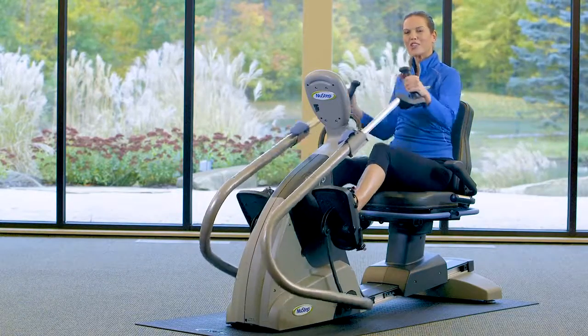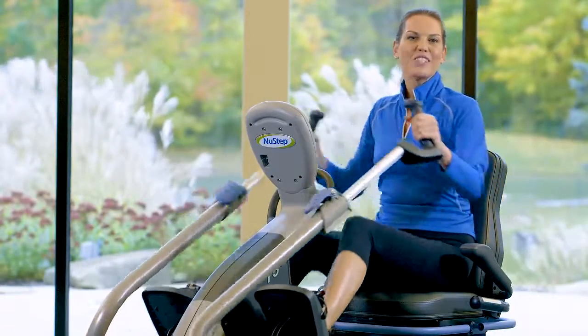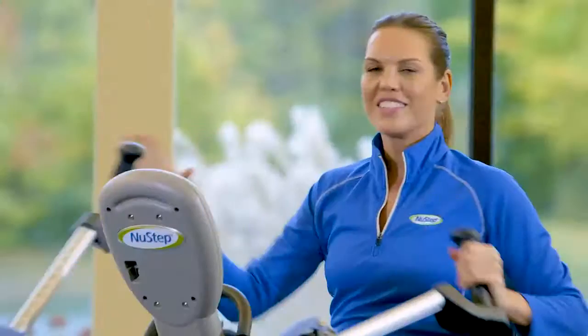The T5 family of cross trainers has 15. At this step we have something called Climb a Mountain. I start at a low level and climb up as far as I can, changing the resistance every 20 seconds. Then I climb back down, reducing the resistance every 20 seconds. It's a great workout.